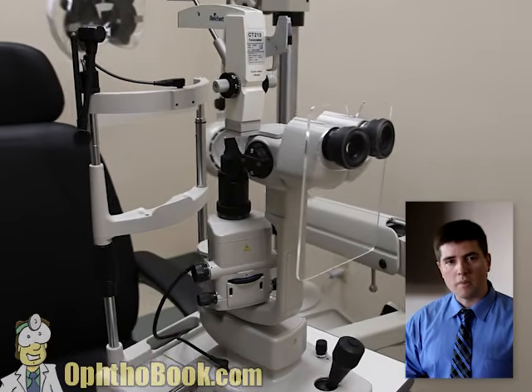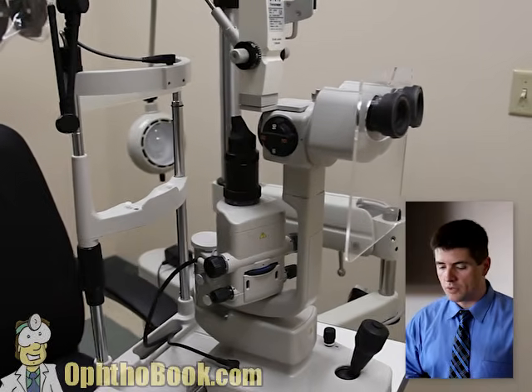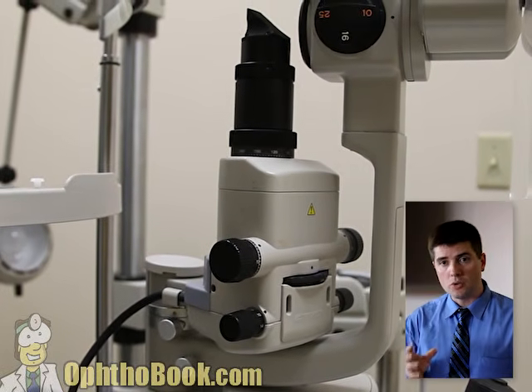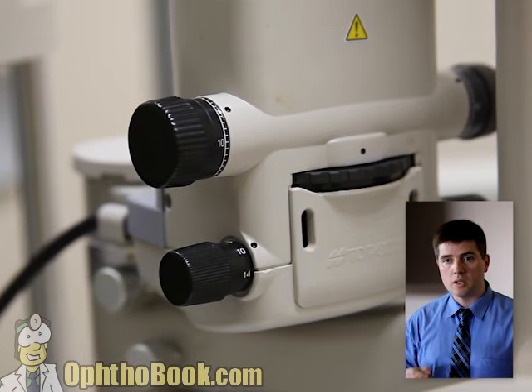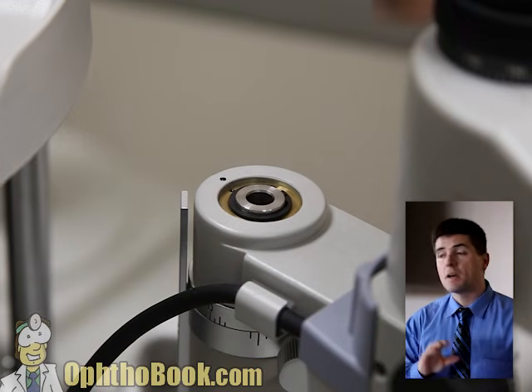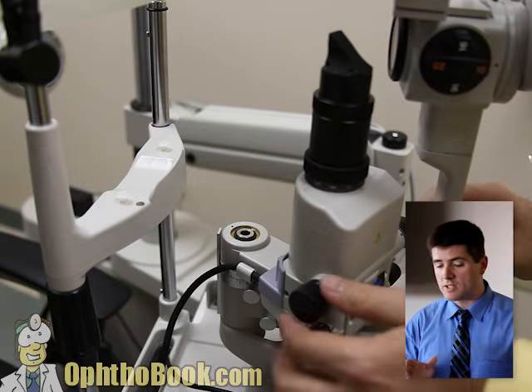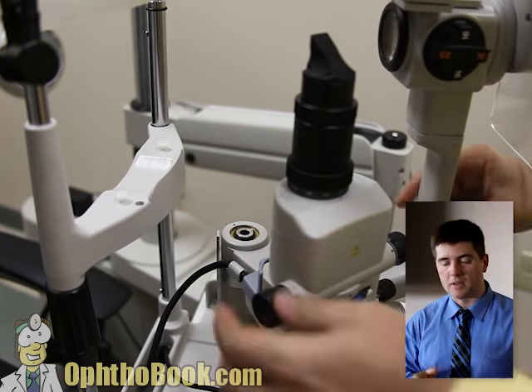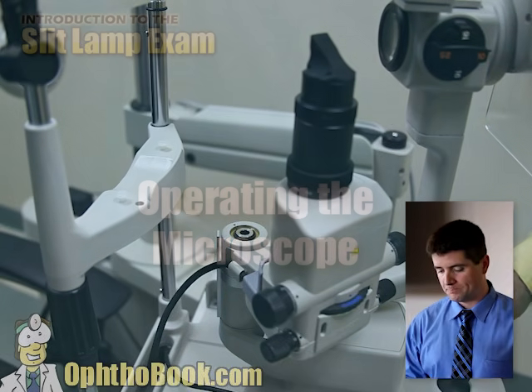This is the modern microscope that we use in all of our clinics. This is a version by Topcon, but many of the other manufacturers are making this style. The light is down below, which is nice, but all the controls are in one central location for controlling our light and our filters and our various settings. But no matter what microscope you use, they all have the same basic principle, and that there's a common rotational pivot point that they all work around in order to focus on the eye.